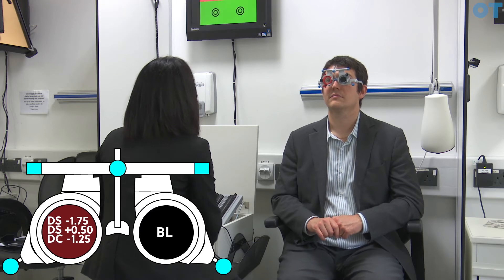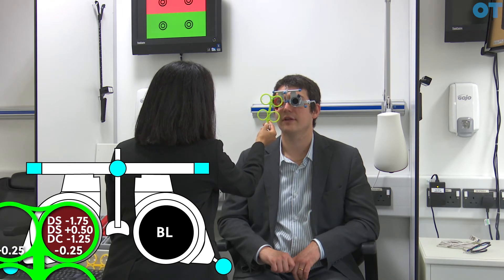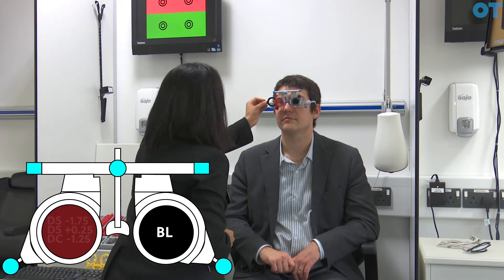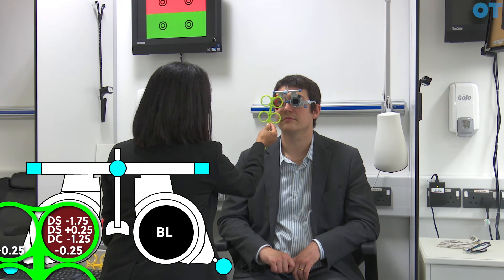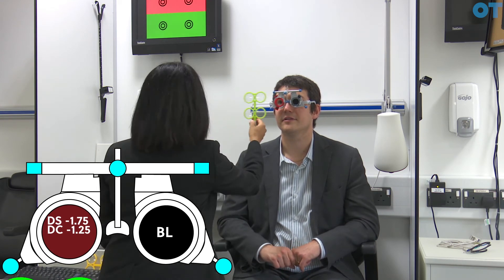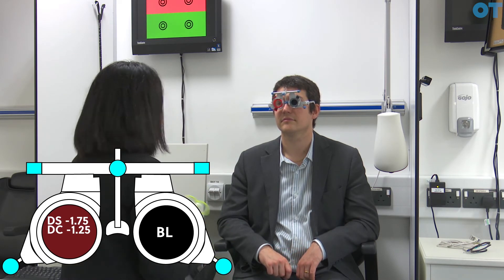Next we go back to the duochrome and check the best vision sphere again. Looking at the circles on the red and the green — do the circles appear sharper on the red or the green? On the red. Still on the red. After progressively adding plus power and checking again, the patient reports both about the same, then back to the red. This confirms we've found the maximum plus, minimum minus for this particular refractive error.